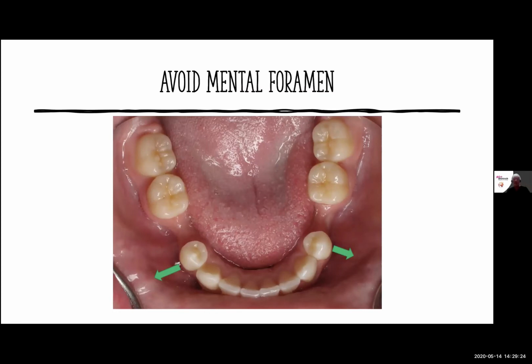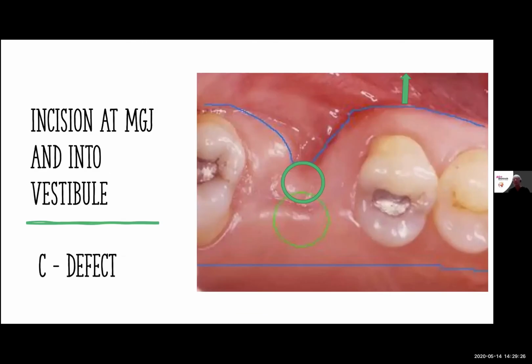And so we're going to come, let me back it up. We're going to make our initial incision on the tooth in front, or the tooth mesial to that, so that the area of the defect will be able to be covered by the bone graft, and we'll be able to extend our graft from good, solid, stable bone back to good, stable bone, so that it will be able to fill in this void here.